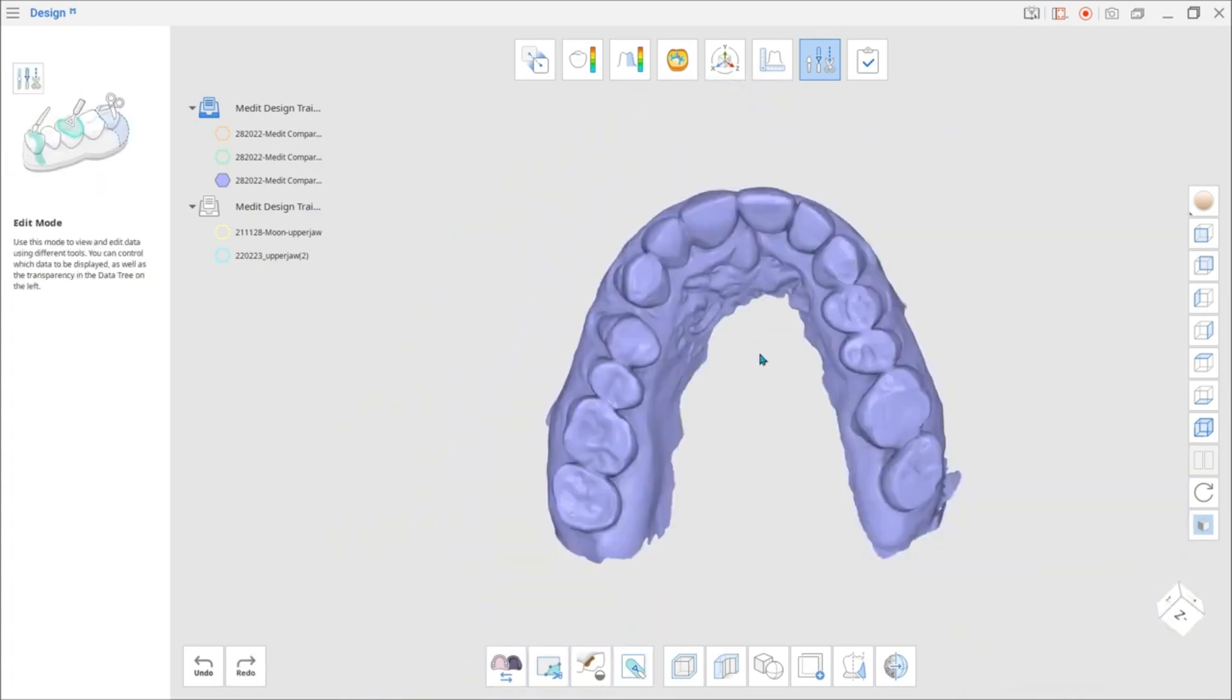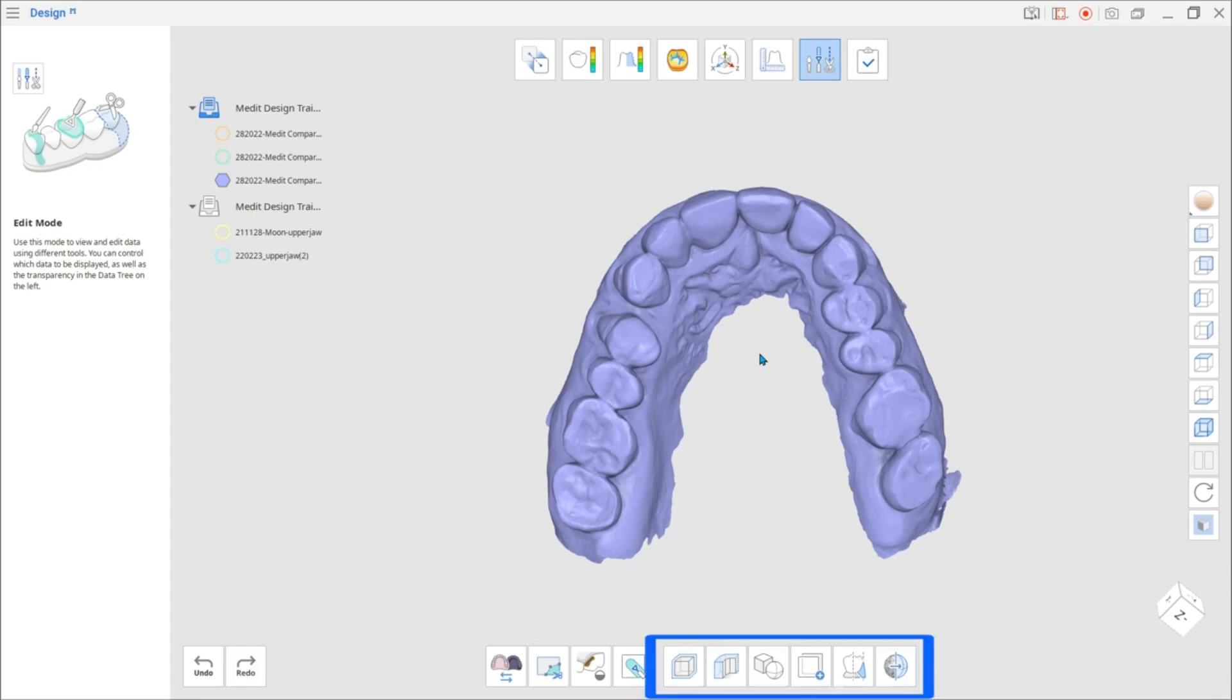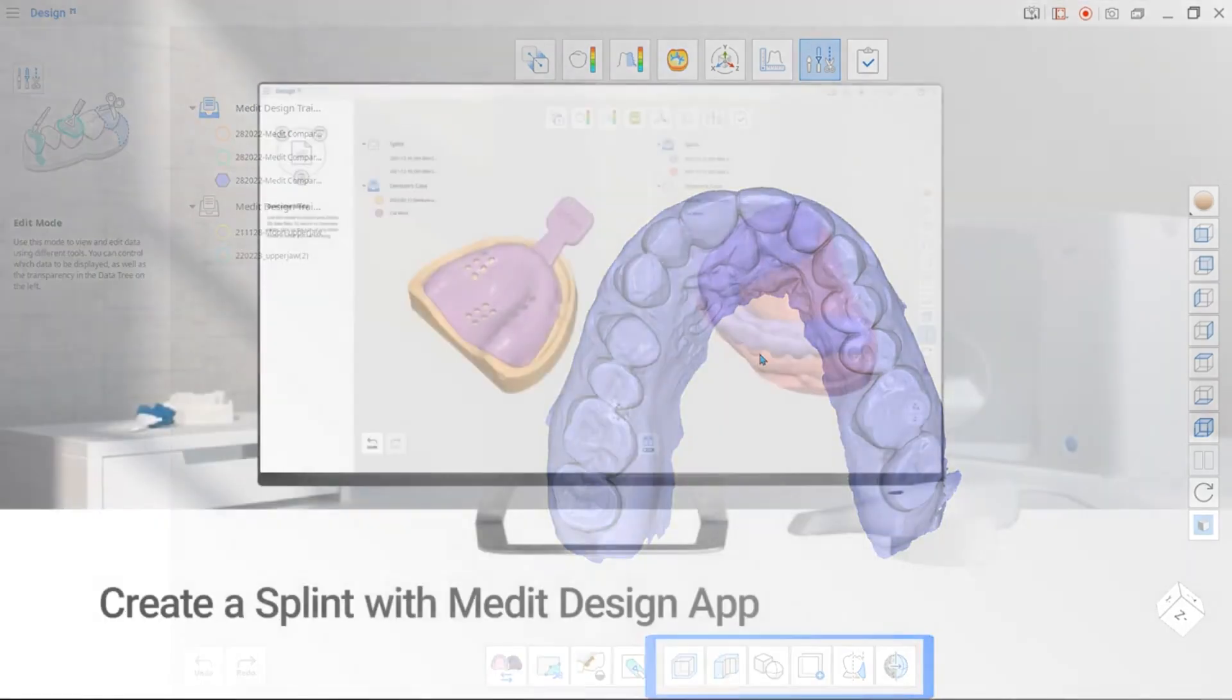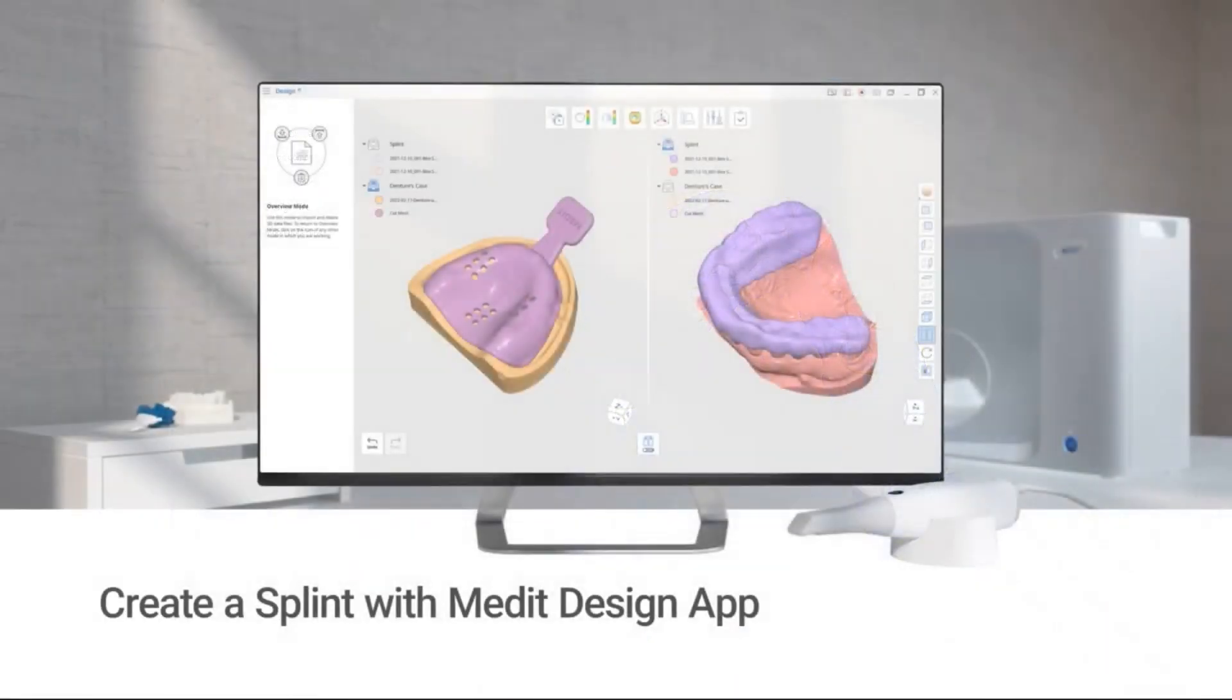Now let's focus on the newly added features of this app. With the help of this function, splint creation will be fast and easy. If you want to learn how to create a splint in this app, please watch our Create a Splint with Medit Design video.